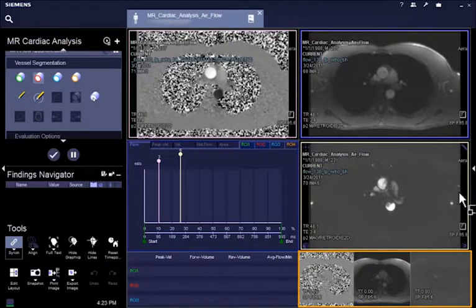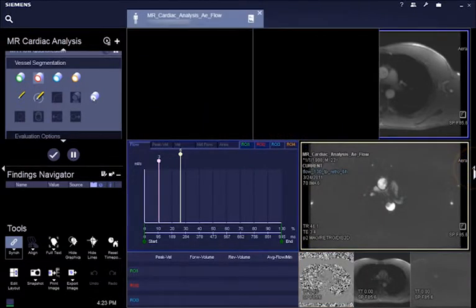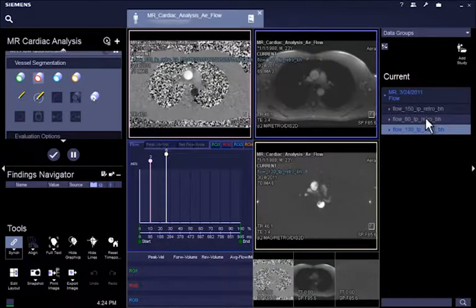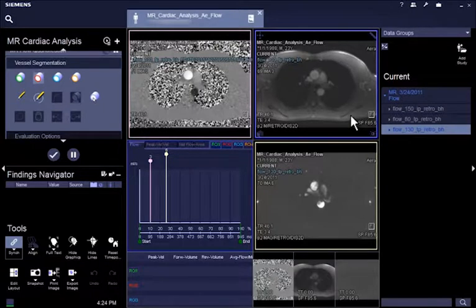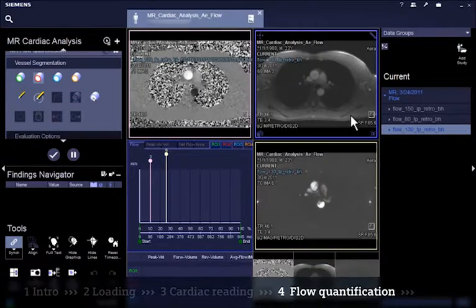If more than one flow study is acquired and you would like to evaluate, for example, an additional pulmonary artery flow, use the drag and drop functionality from the series navigator to load this respective series into the working segment.